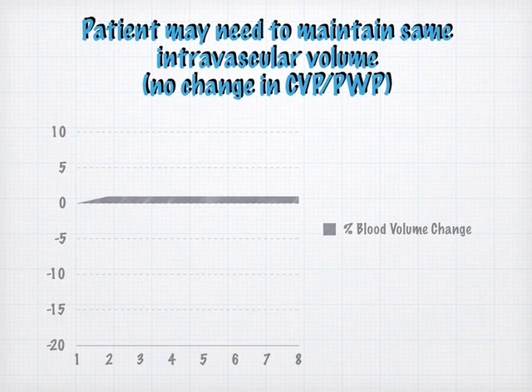And to me, that was what the magic of this device was, is that in hemodynamically unstable people, I could remove fluid at the exact same rate that they were recruiting fluid so that I did not change their CVP, wedge, their stroke volume, or cardiac output. And that didn't mean that I didn't remove a great deal of fluid on patients.